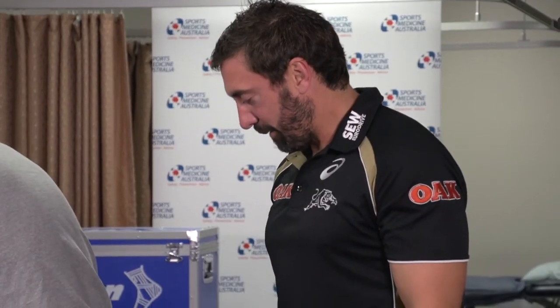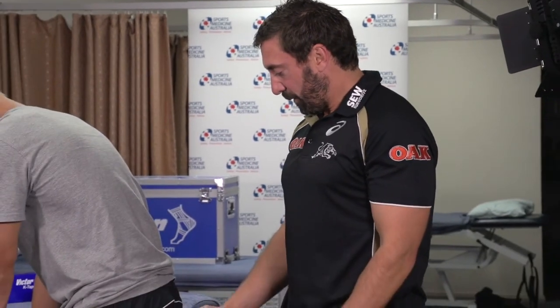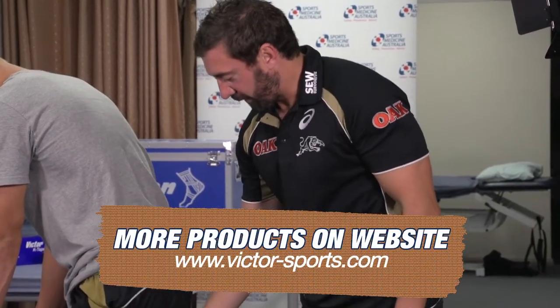So that's our basic hamstring applications. That same principle can be used on just about any muscle group in the body. So again, for weakness, we're using a shortened position. For tightness, we're putting it on a lengthened position.